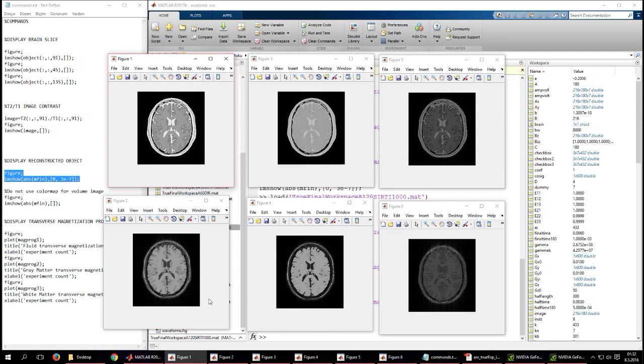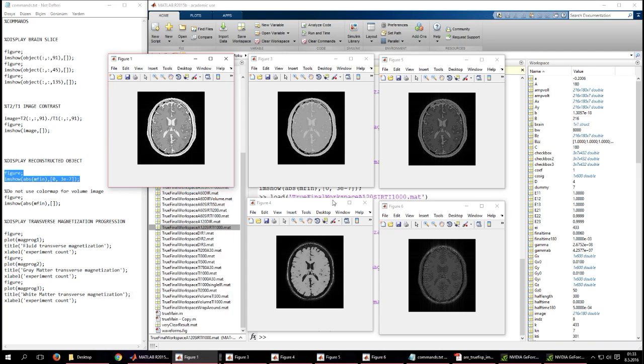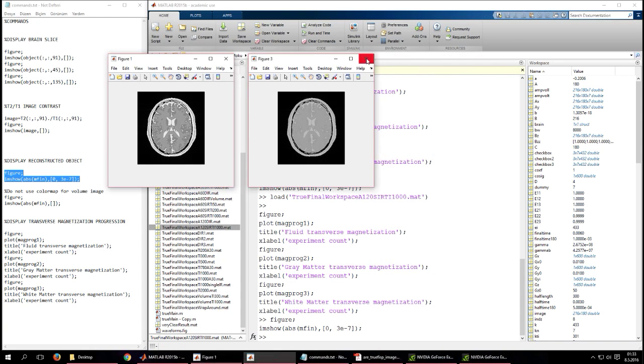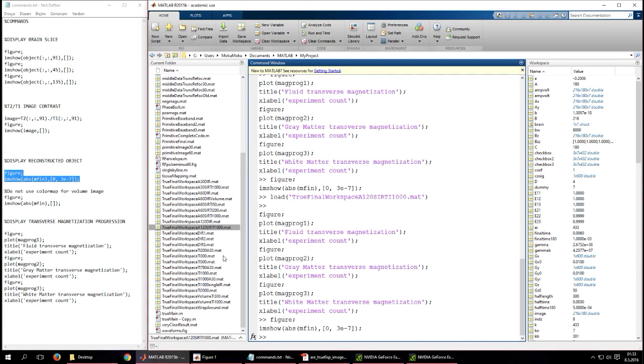Finally, I will demonstrate a result from a simulation where the signal is acquired by integrating over a volume of 7 mm thickness or 7 planes equally, and the parameters from the first simulation are used. The flip angles of excitation pulse are plus minus 60 degrees, and double inversion recovery with the same time values are used.